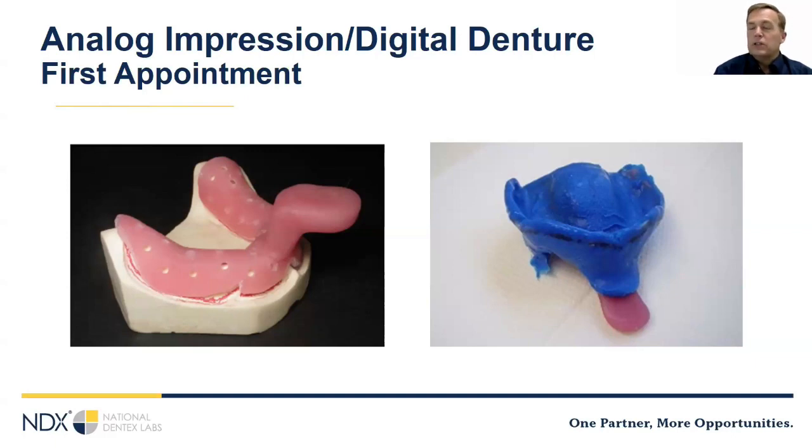The digital denture will have a very accurate fit to the model, but the variable will be the correspondence between the model and the mouth. So because of the accuracy of the digital denture, you really want to focus on taking your time to get that nice result for the master impression.